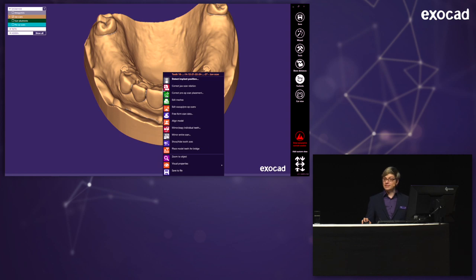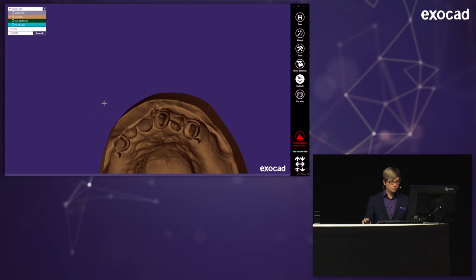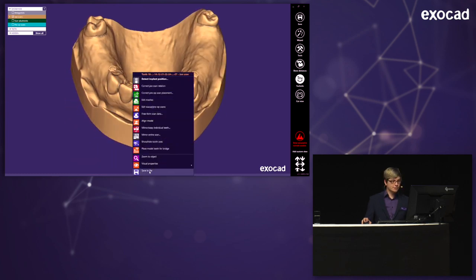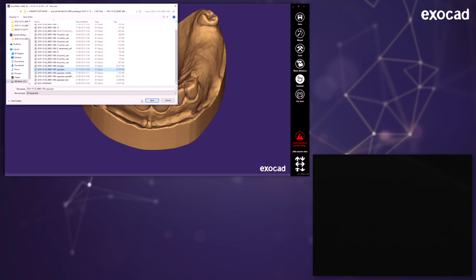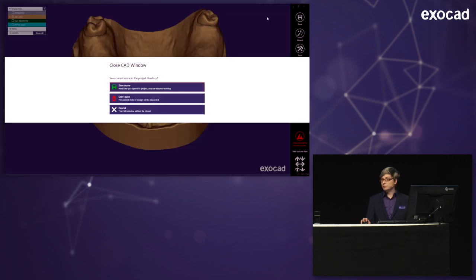And you can actually save a mesh at any given time to an STL file. And because this is just one single mesh now, I'm going to save this to a file. I'm going to overwrite the old upper jaw. And this has a simple reason, because I'm going to start the partial framework software now. And the partial framework software will just take the model which is named like the upper jaw. And if I replace it, it will take this model instead.